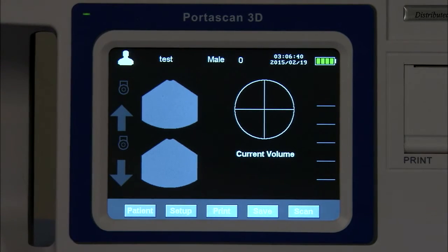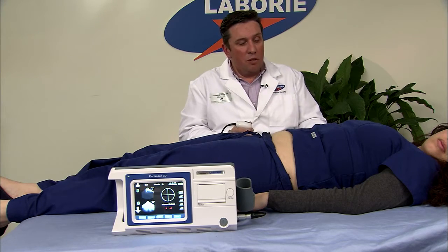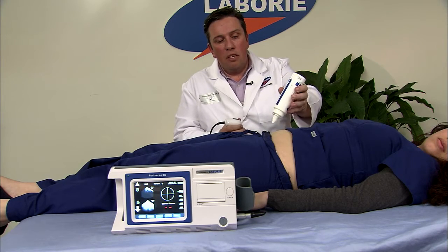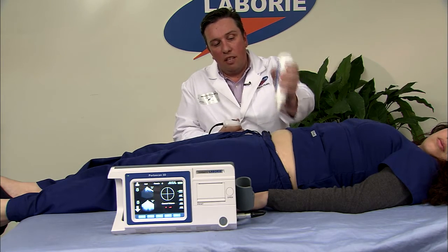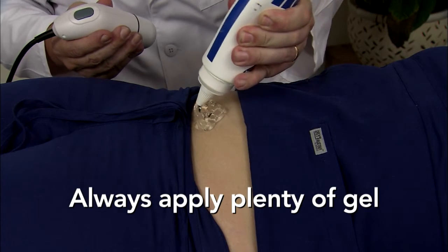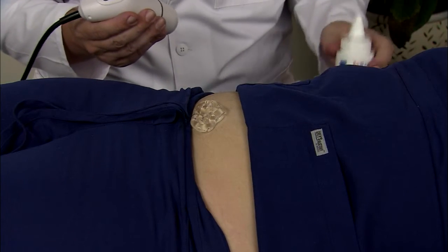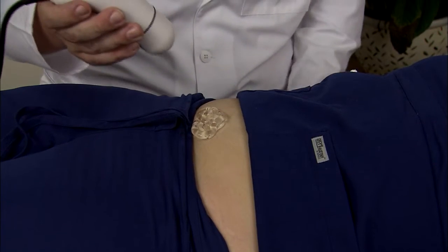Now we are ready to perform the scan. First you will need to apply ultrasound gel to the patient. Always make sure that you apply plenty of gel — I'm applying a substantial amount here. This is due to the fact that if you do not, you will get a light scan which will give you inaccurate readings.